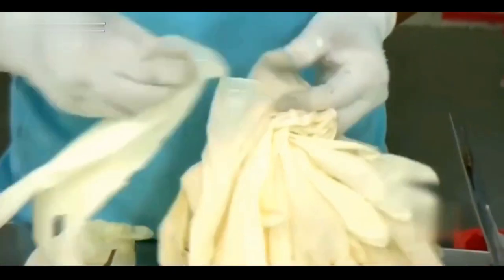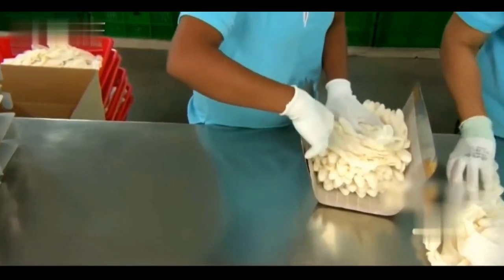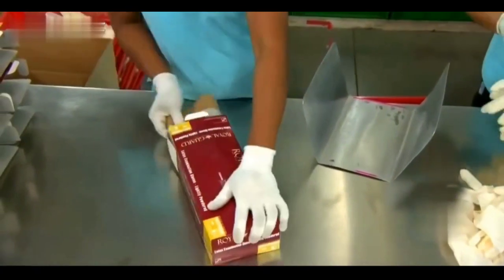At this point, the qualified rubber gloves will be shipped to the workshop. The packing workers will sort out the gloves and then pack them in boxes of 100 pieces each.